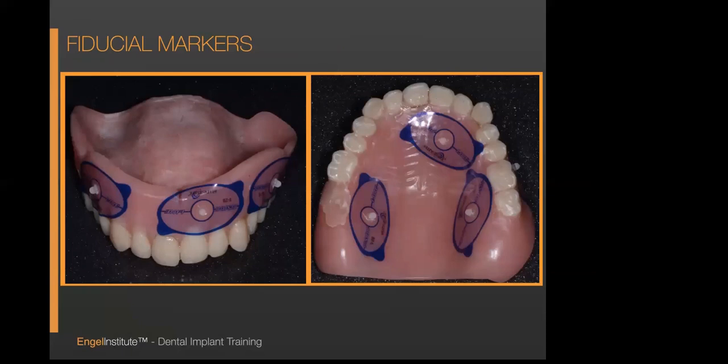Now, this is where we differentiate between a person with teeth and one that doesn't have teeth. And this is pretty much where guided surgery all started. Now, we've made movement in this direction as well. So if you've heard about duplicate barium sulfate dentures or gutta-percha balls or all of these things, we have done all that. I have done all that. We have moved to something that is very minimally invasive. We don't have to put any holes in a denture. We don't have to spend the money duplicating a denture at $250 or whatever it is, or if we do it in our office, the time.